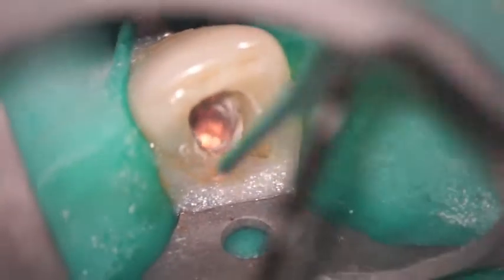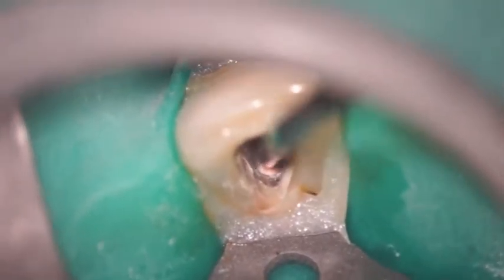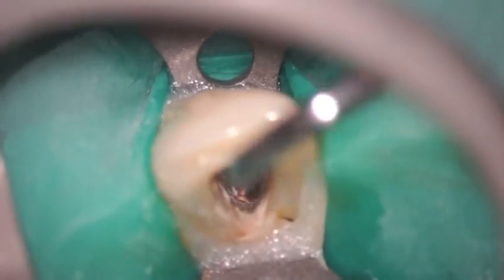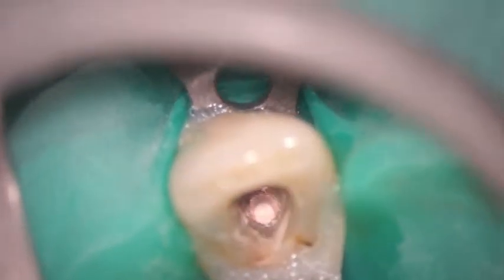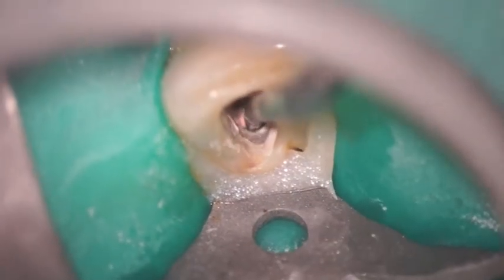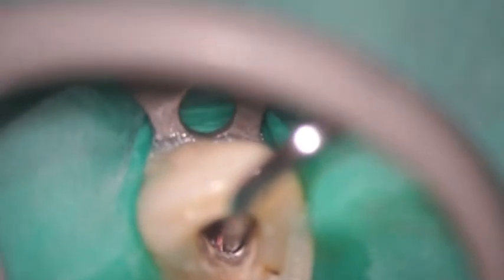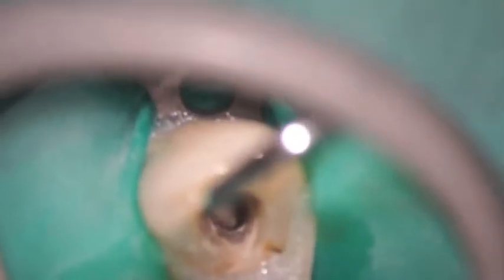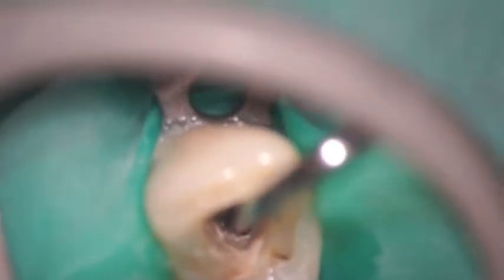Now we're going to take the calamus heat plugger tip and drive it down into the root canal system, condensing it vertically and also creating tremendous hydraulic pressure, then immediately following it up with another calamus plugger — a hand plugger — that allows us to again condense that warm gutta percha apically and vertically, capturing the maximum amount of three-dimensional anatomy in the root canal system. Now we're removing with the calamus heat tip another aliquot of gutta percha, then going to a smaller calamus plugger and condensing that gutta percha again vertically, capturing the maximum amount of lateral and tertiary anatomy in the root canal system.